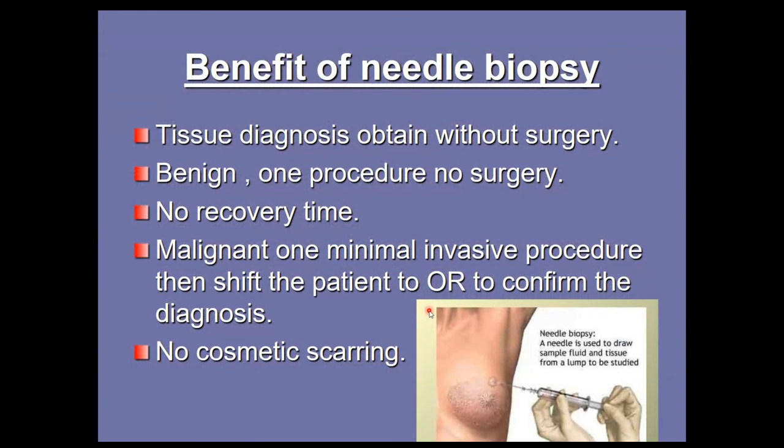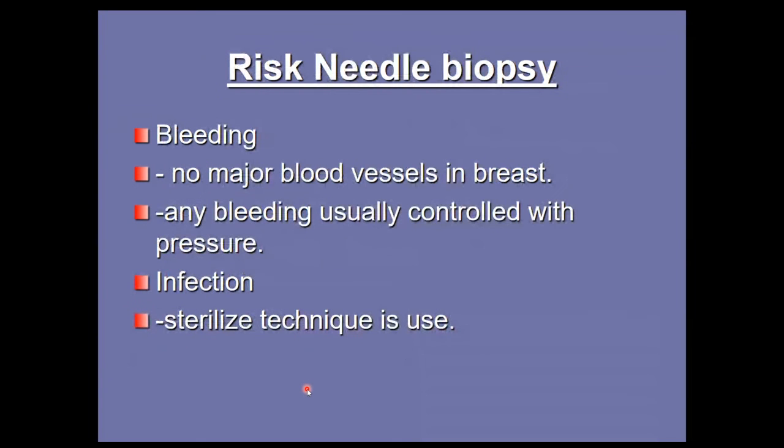So, tissue diagnosis can be obtained without surgery with the help of ultrasound. For a benign one, a procedure with no surgery every time. For a malignant one, a minimally invasive procedure can be done, then shift the patient to the OR. As for the risks of needle biopsy, there are fewer chances of bleeding because there is no major blood vessel in the breast, and any bleeding is usually controlled. To reduce the chances of infection, we can use a sterilized technique.